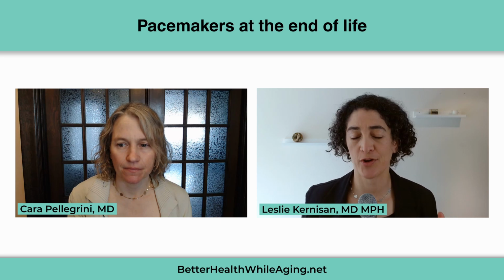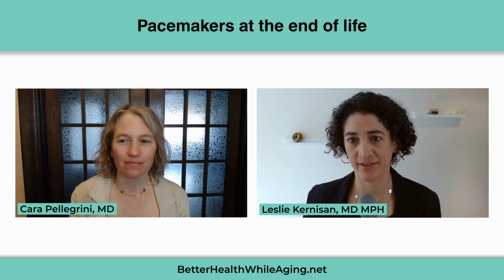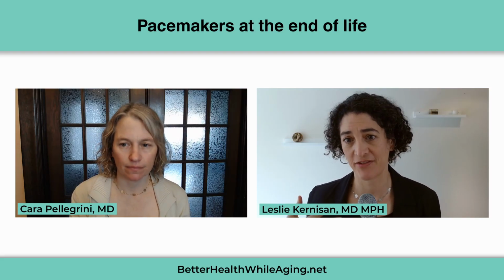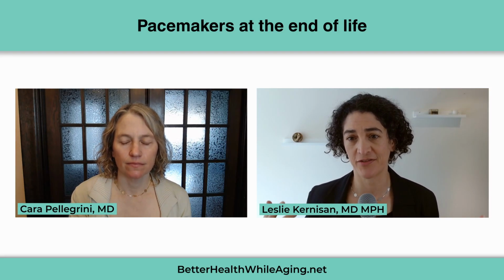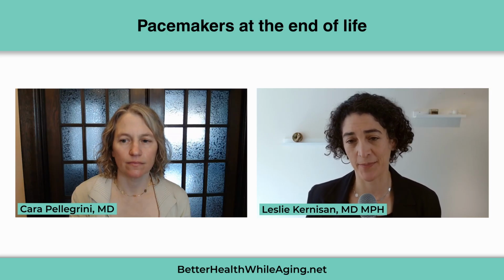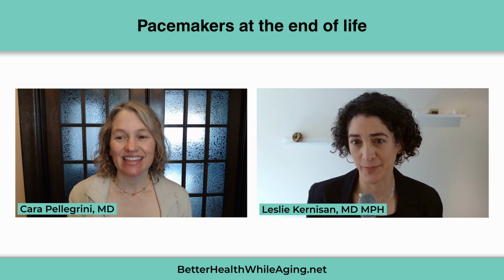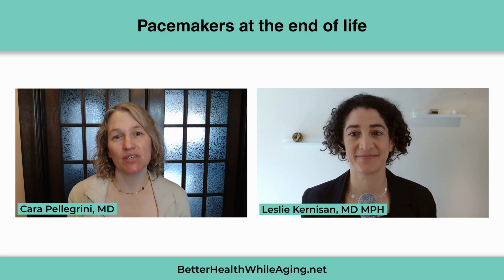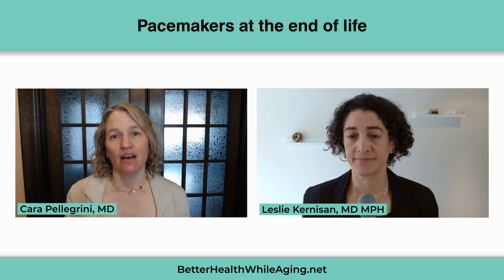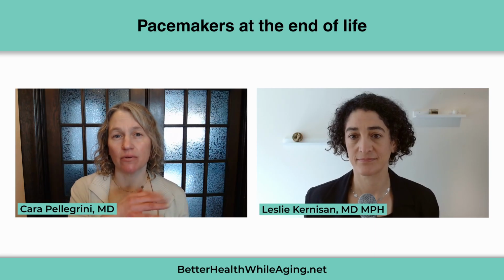Yeah. So to be clear, if people have a pacemaker, when they die, people aren't generally feeling the stimulus of the pacemaker, so it's not going to really make a difference to how they feel as they die. But if they have the device that actually shocks them, the bigger device, if it's not turned off, then when people are dying and their heart is starting to skitter to a stop, the device might shock them. It might. But it might not, because the heart might not be going super fast. Correct. So it depends. Sometimes as we die, what happens is the heart goes into pulseless electrical activity, where it'll have some electrical activity, but it's not creating a squeeze function.